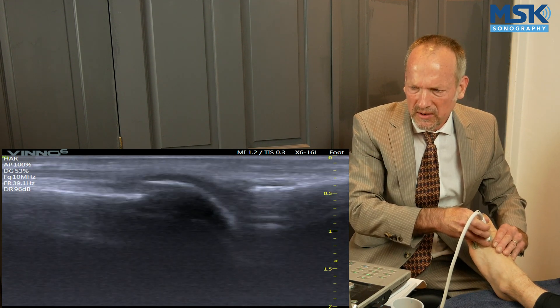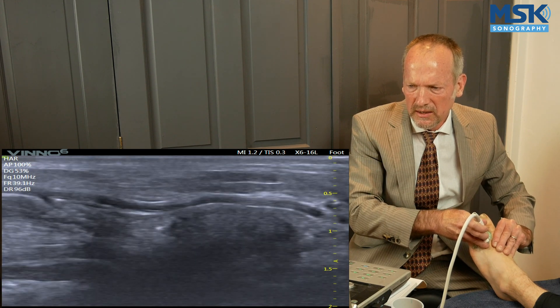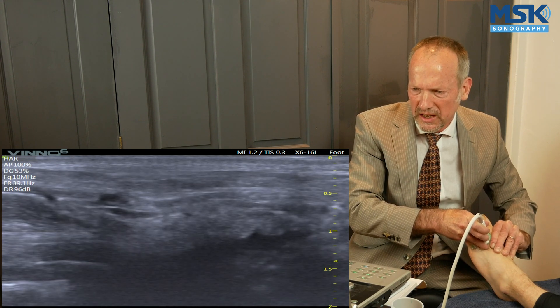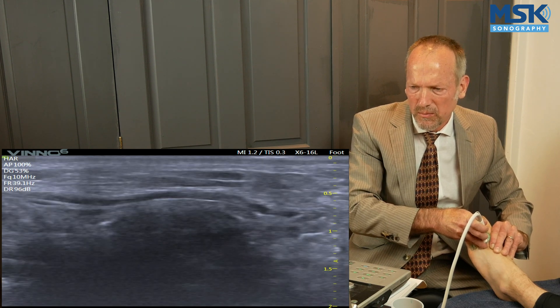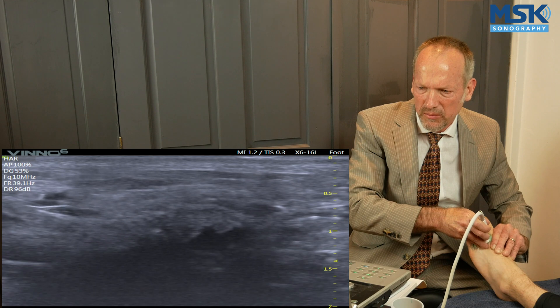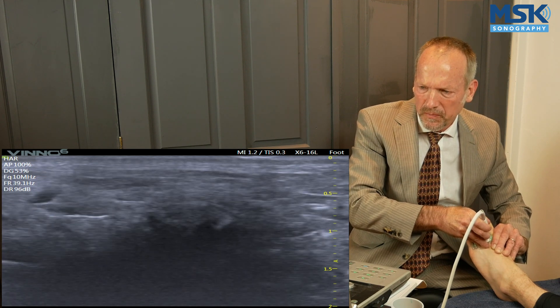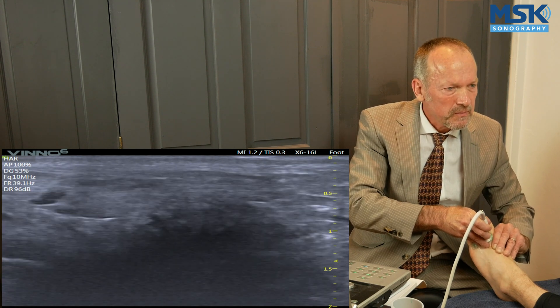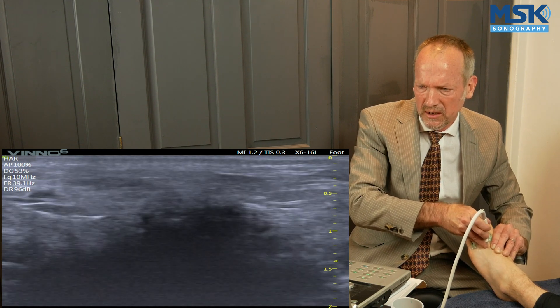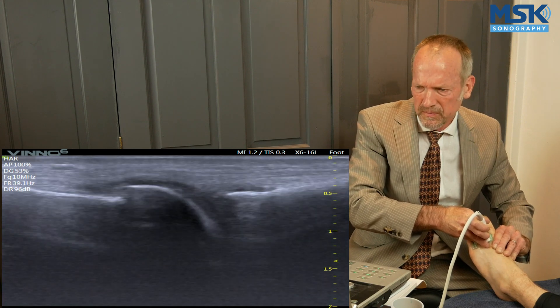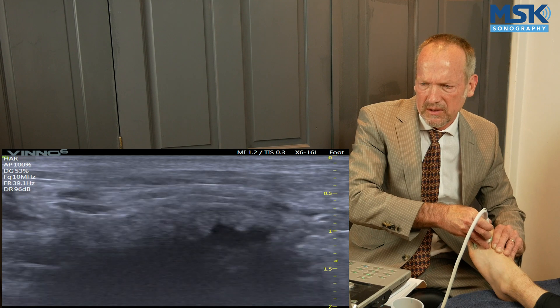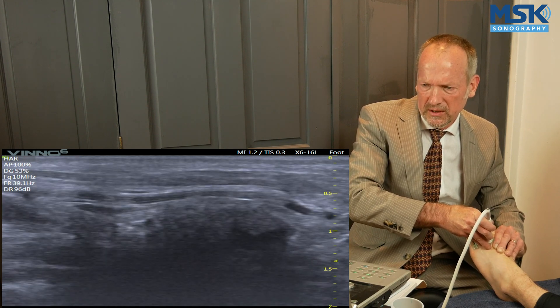So we're going to go back to the second metatarsal, follow that line, and just with my thumb in that metatarsal space, just pushing. You can actually see some mobile tissue there in our region of interest. We're just going to scroll back to this picture — because we can actually see a bit of fluid. Is that painful there? Okay. This patient is asymptomatic. There's some evidence of fluid in that region through here.